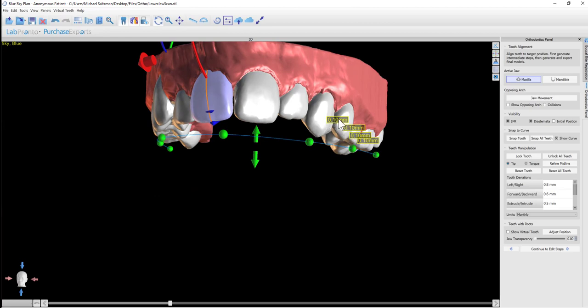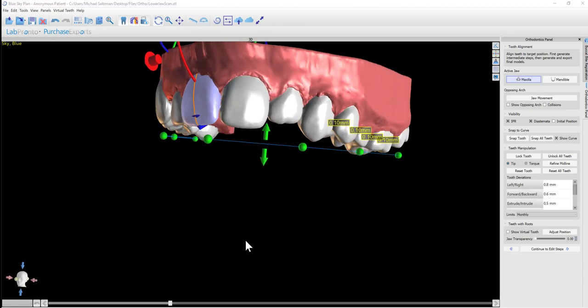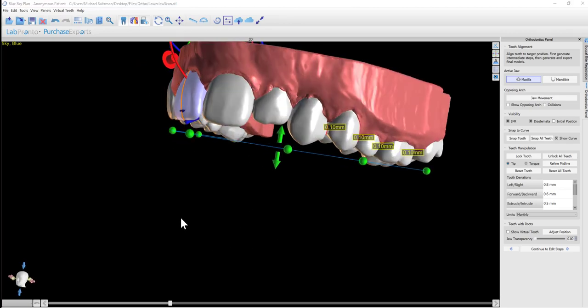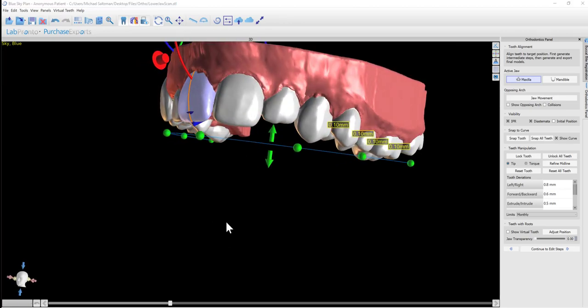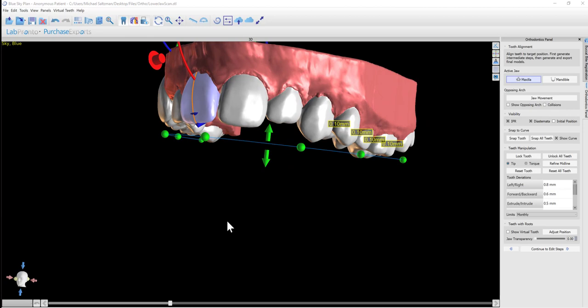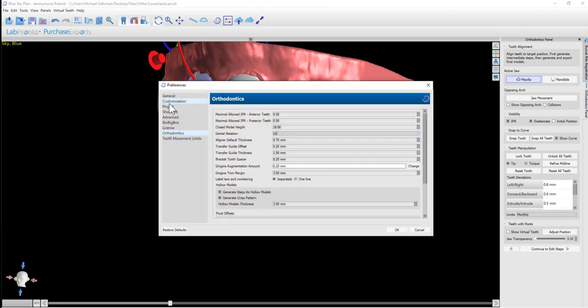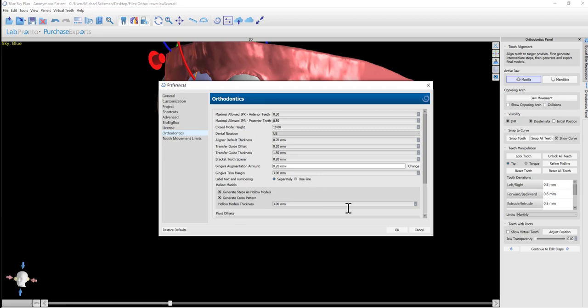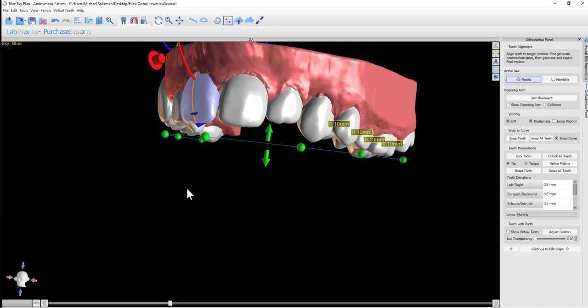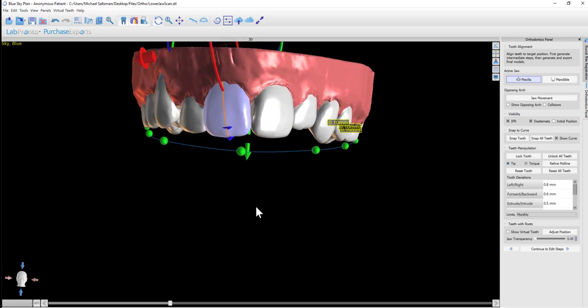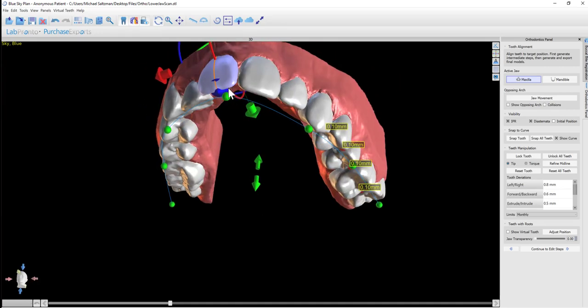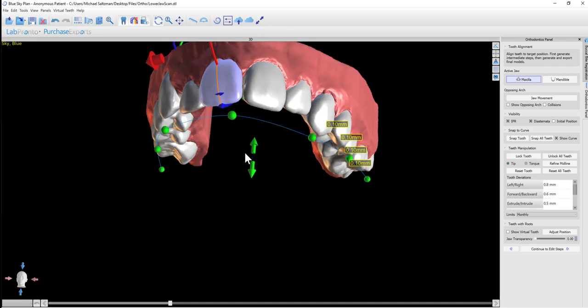We see that the IPR between these teeth is 0.1 millimeters, which seems to be a reasonable amount. We have the default settings in Tools, Preferences, Orthodontics, maximal allowed IPR for the anterior and in a separate setting for the posterior. If you want to change those default settings, you can go ahead and do that. But otherwise, generally there is no need to do that.